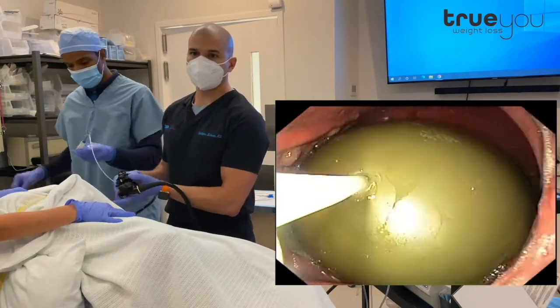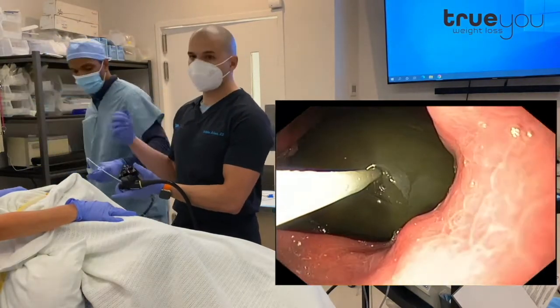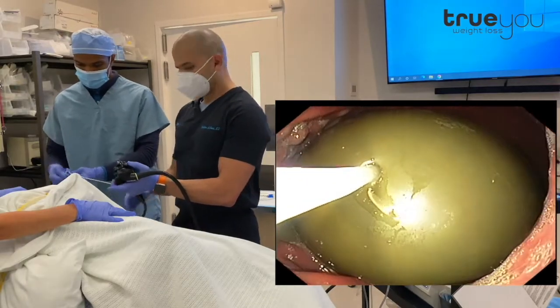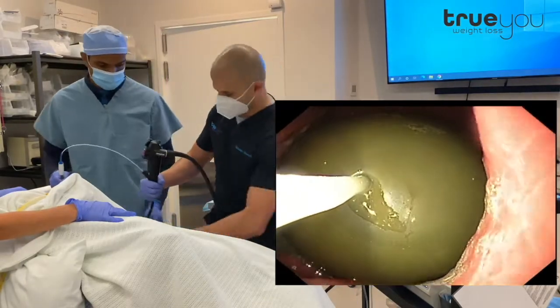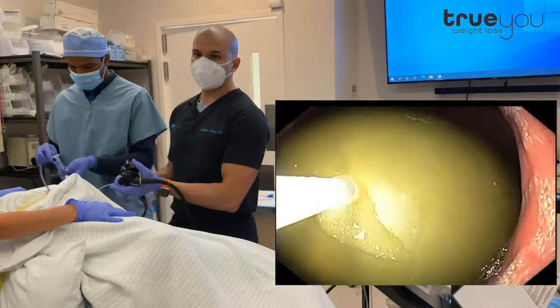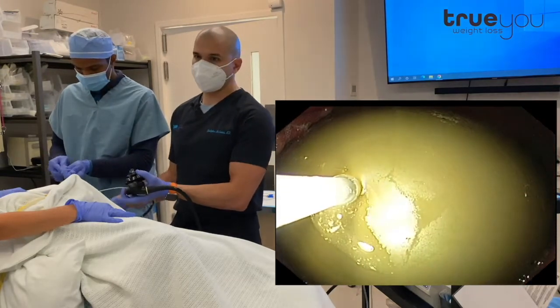There's a wire that goes through this catheter. We take that out and then we connect this to suction. We're going to suction all the fluid out and then we can just drag the balloon out. Once the balloon is out, our patient will resume a regular diet today.